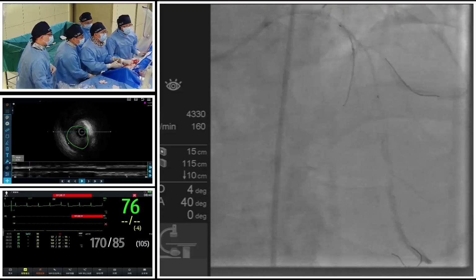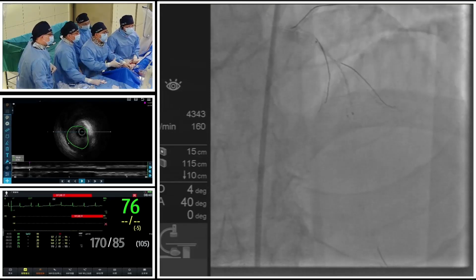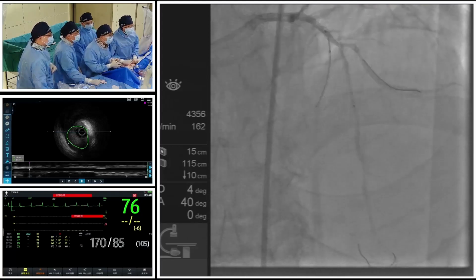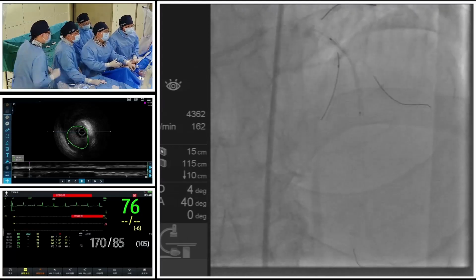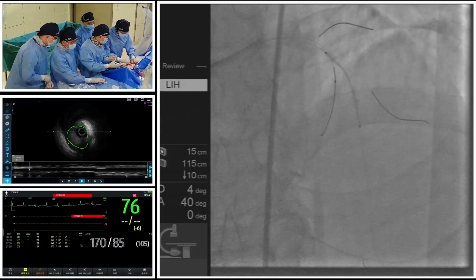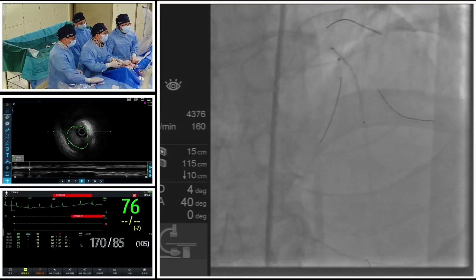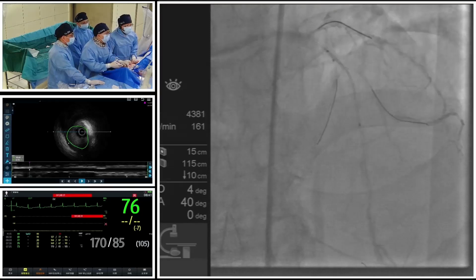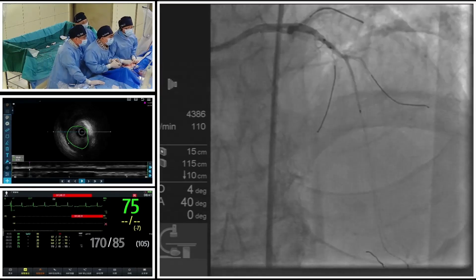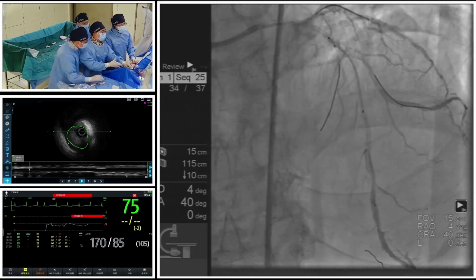However, all these techniques, I think, have one similar general idea: to use a device, either a balloon, a wire, or a microcatheter, to occupy the space to avoid the carina shift of the bifurcation site. So whether you're jailing a wire or a balloon or any other device depends on the detailed information of the bifurcation.